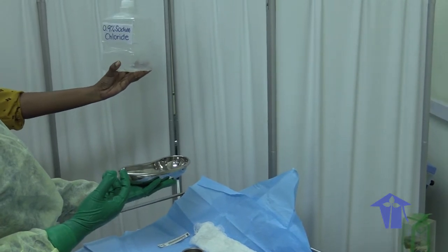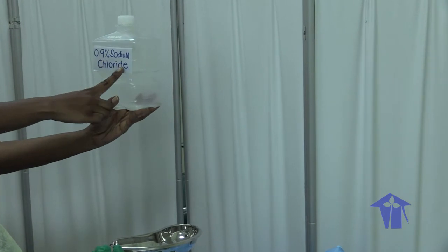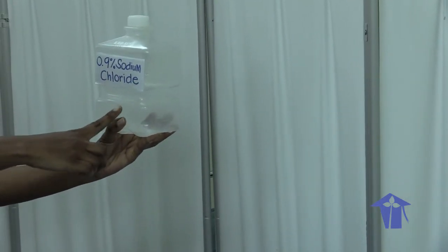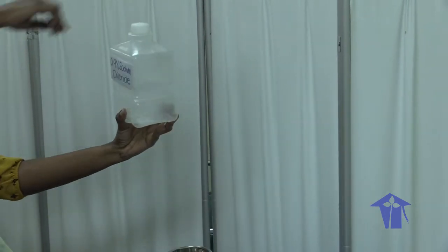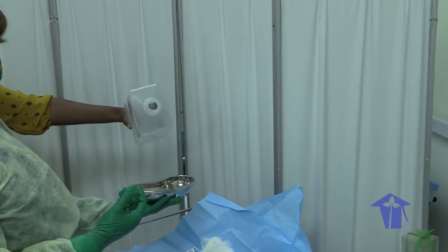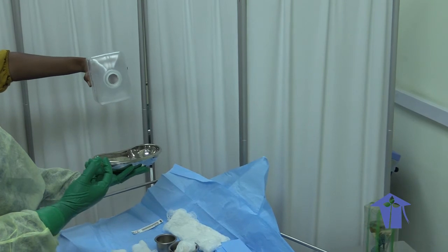Before pouring your solution, ensure to check the name of the solution, expiry date, date and time the solution was opened, and the integrity of the container. Open your solution and pour away from the label, ensuring to maintain sterility.